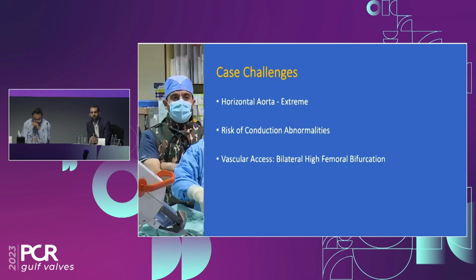Very good. Any comment from the audience? Who would use a balloon expandable for this case? Who would use, Sundus, you like the balloon expandable. And I like self-expandable. So what is your approach? It's horizontal, super horizontal. It's 90 degrees. As horizontal as it gets.